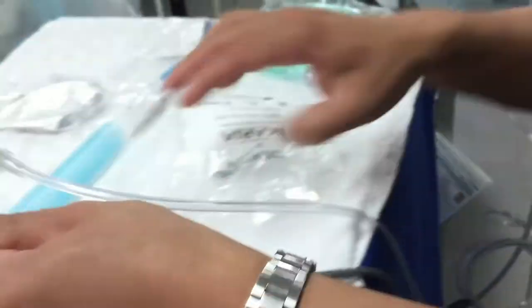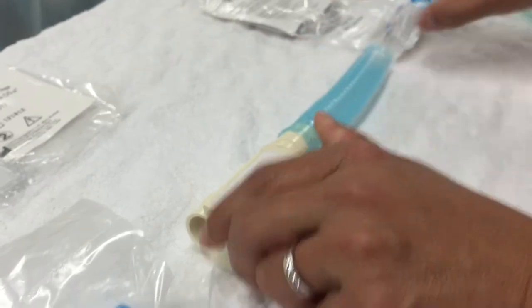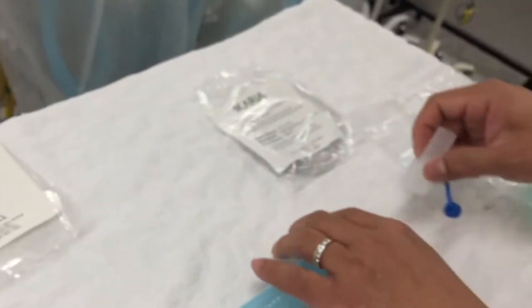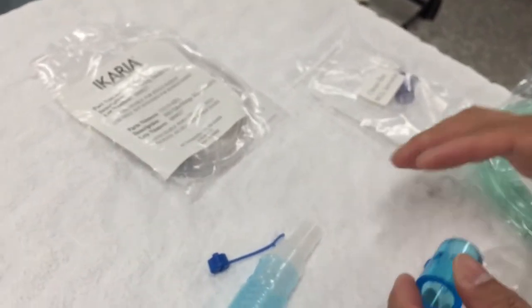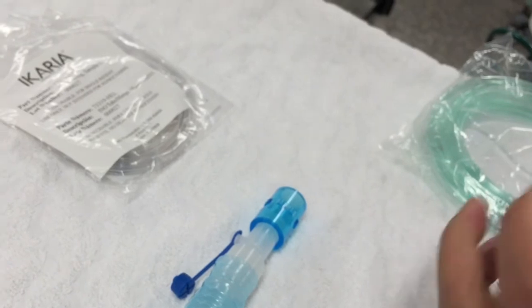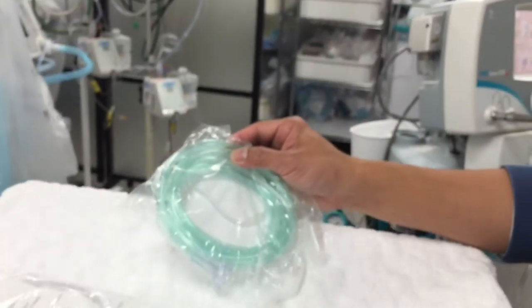Now if you look at how this whole thing is set up — you just open up the whole kit and put all of them together. That connects there. Open this one — that connects there. Open your two adapters — that connects there. Open this other adapter — that connects there. And if we're doing a patient that's not on a ventilator, then the nasal cannula just connects to that nipple.